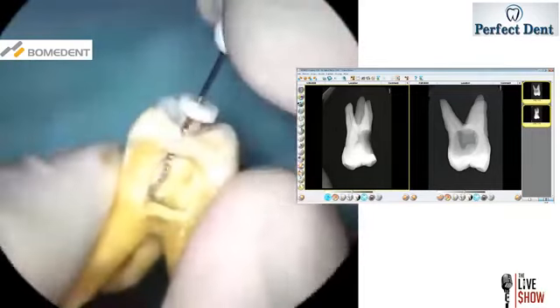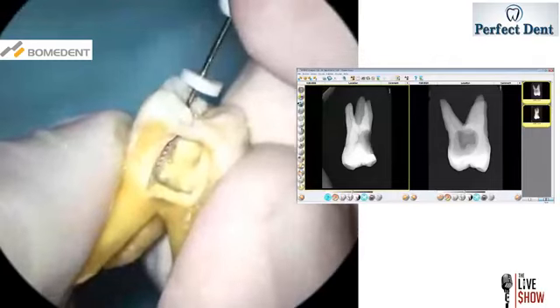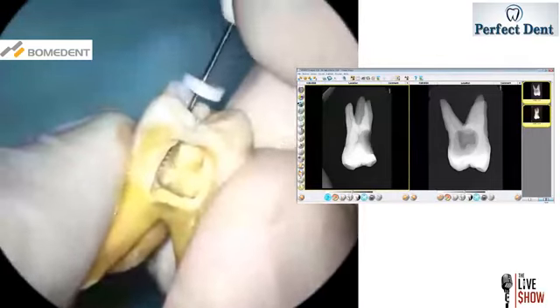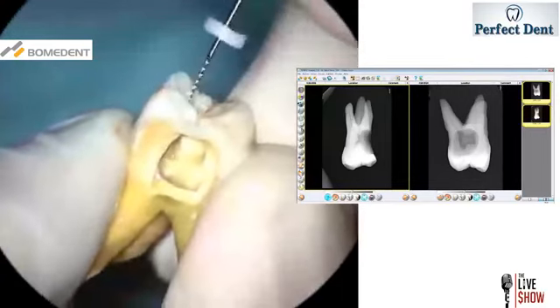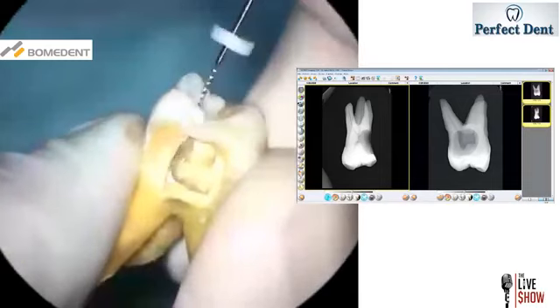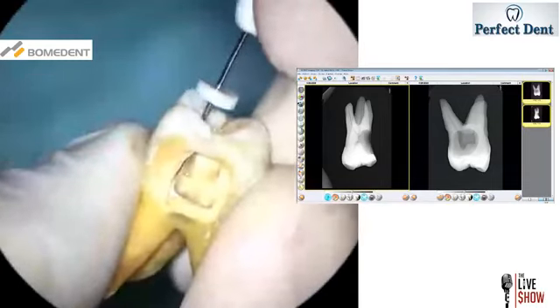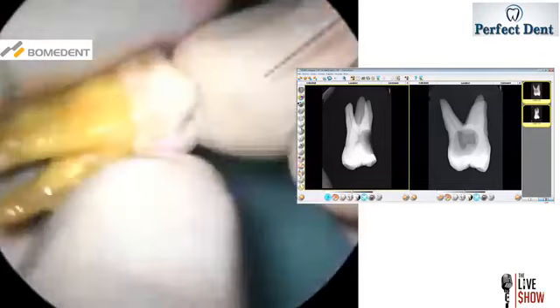So now I've got a tightly fit instrument in my mediobuccal canal. I'm going to go in, work the instrument a few times. There you go. And now the instrument is relatively loose in the canal, goes in with some ease and comes out, not completely loose. But now I know that my starting point of my canal here is a 15 to the working length.